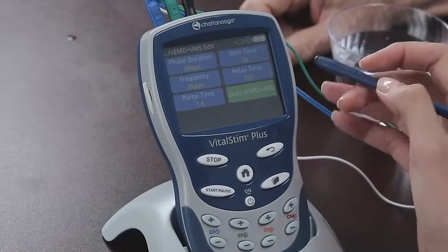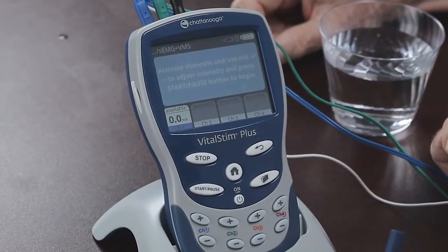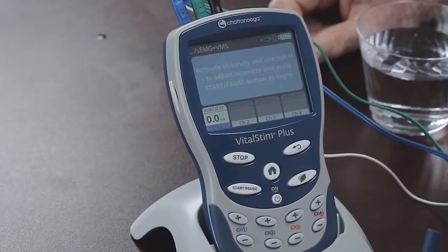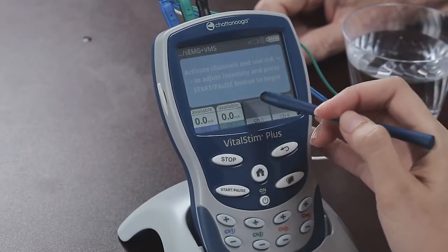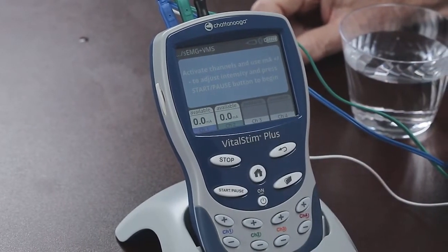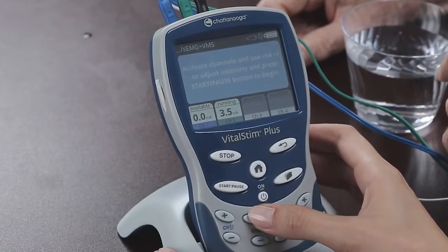Press the Start Surface EMG plus VMS button and we bring up this screen. Channel 1 is already active and it will remain active because it is the triggering channel. But in this example, we are not going to stimulate through it, so we'll leave the intensity at 0 milliamperes. We select channel 2 in order to increase the therapeutic intensity. Let's do this for this patient as we have done before.